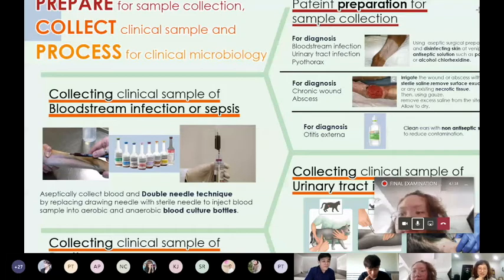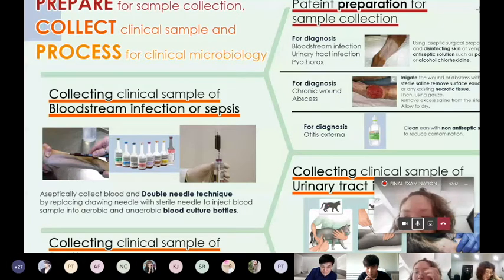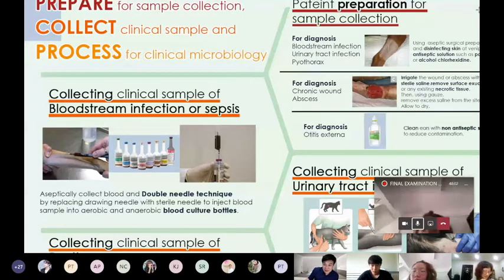For example, you can see the picture of hemoculture. The purple one is an anaerobic medium. It's a lytic anaerobic medium that lyses blood cells and releases intracellular organisms. The blue one is an aerobic medium, and there is a plus anaerobic medium. They are different because each hemoculture bottle has characteristics to neutralize bacteria differently, so they have many colors like that.